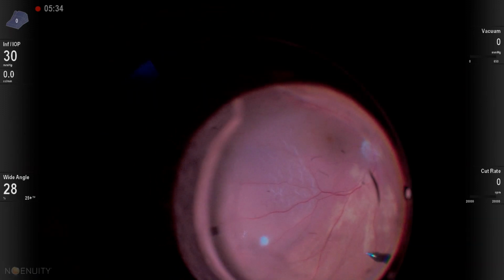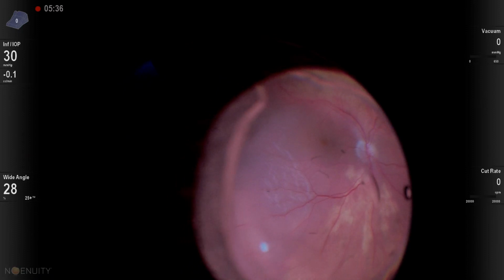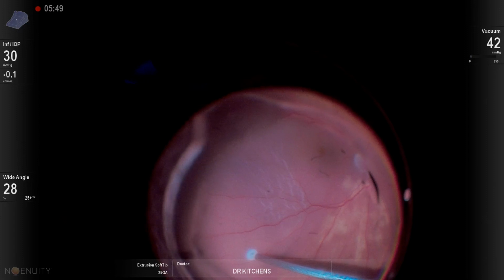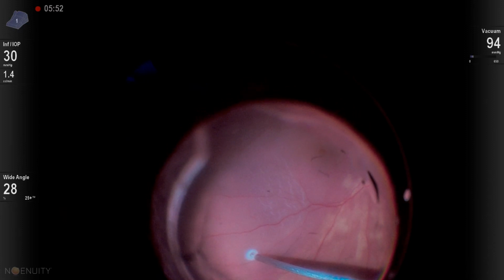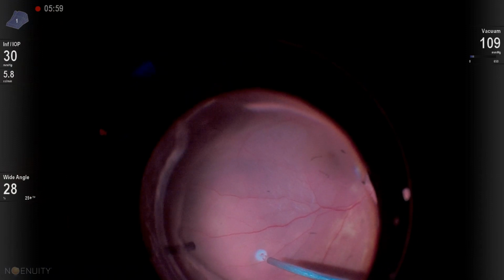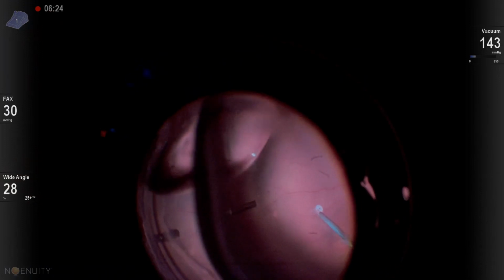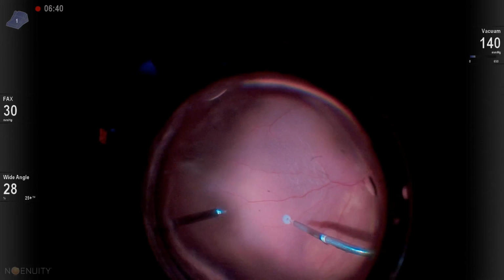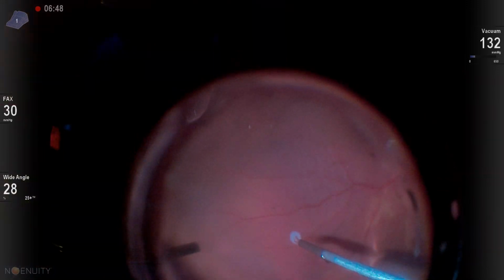Regardless, I'll go ahead and make a draining retinotomy. If I don't find the break and can't drain through the break, I'll make a draining retinotomy. I, by far, like to make my draining retinotomies superinasal to avoid epiretinal membrane formation, but in this case, I have to make it supratemporal. I roll the eye so that I try to get a single bubble. This just helps with visualization. And I have my soft tip right over my draining retinotomy here.